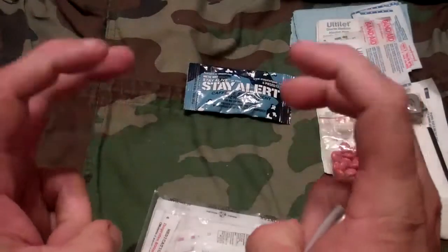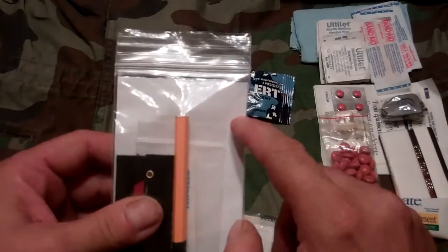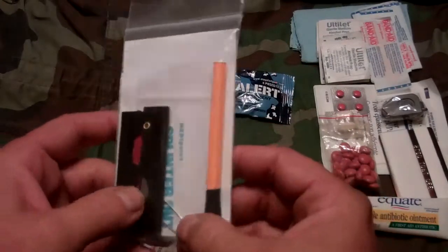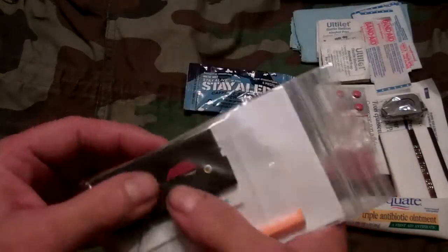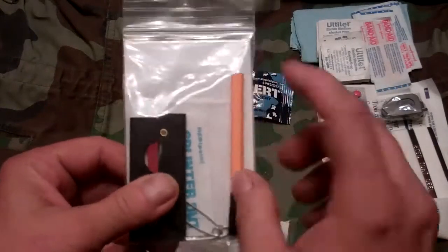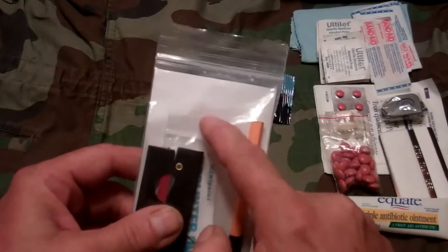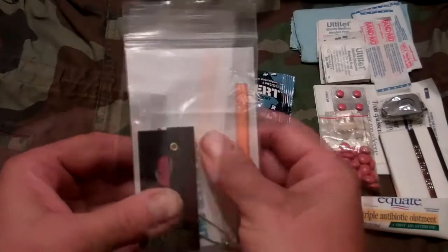The first module, they have them divided up into modules, is a couple of pieces of Write in the Rain notebook paper, a pencil with a cover so it won't poke the bag, a couple of splinter outs, a couple of safety pins, and a folding razor blade and what appears to be a little hacksaw blade. The Write in the Rain paper is expensive. I've got a couple of these notebooks and they ain't cheap, and they're worth every dime. I know that. That's the reason I carry them.